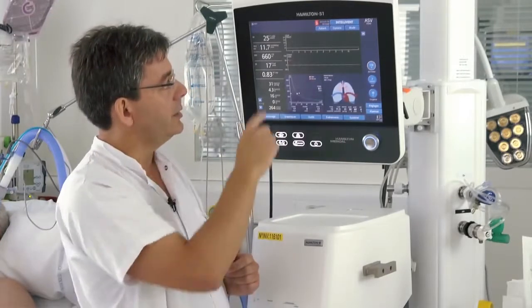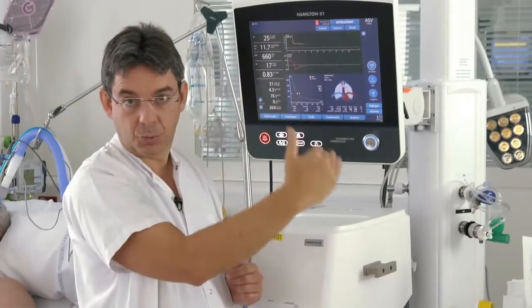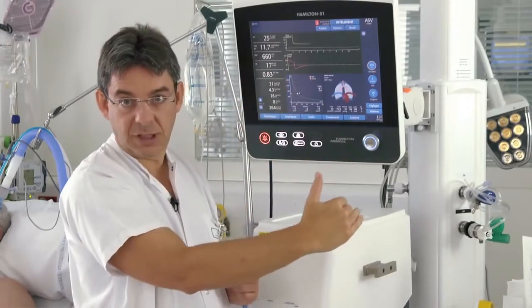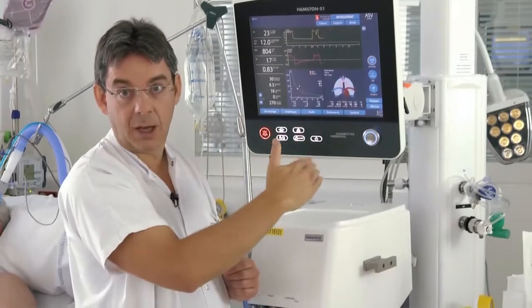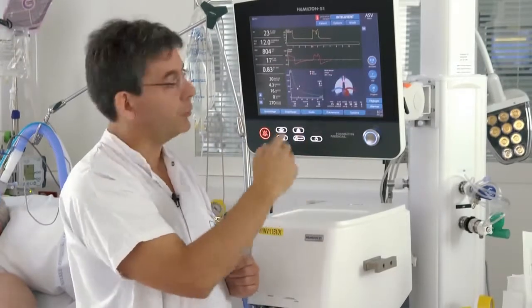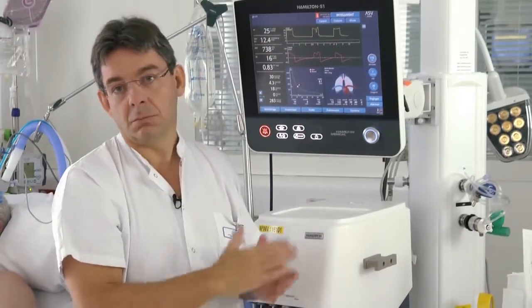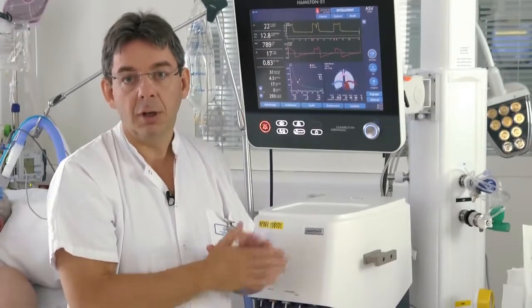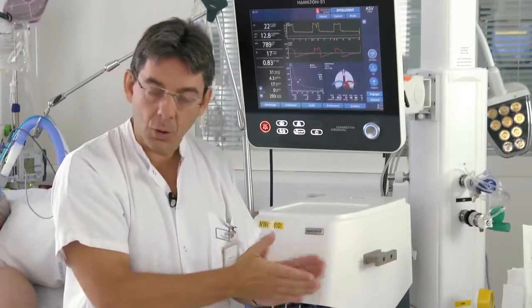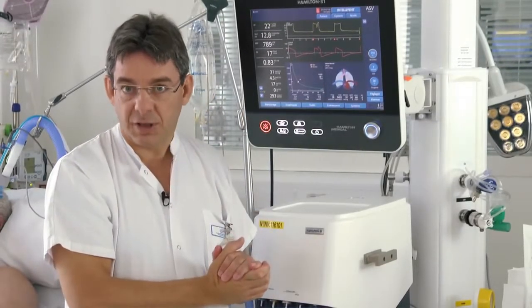As we decrease the target minute volume, the pressure support will decrease. When the pressure support is below 16 cmH2O, we may proceed to a spontaneous breathing trial.